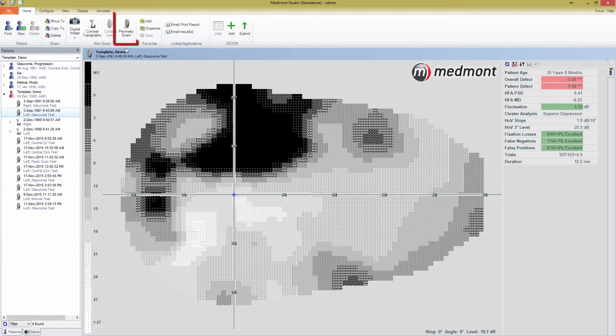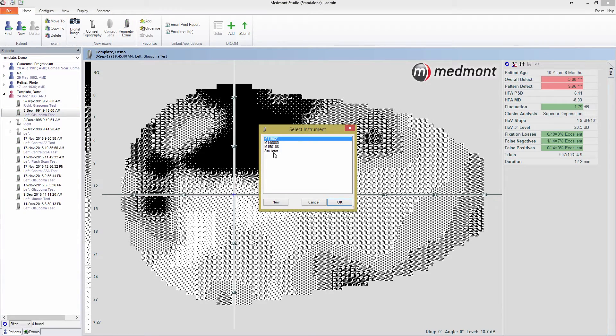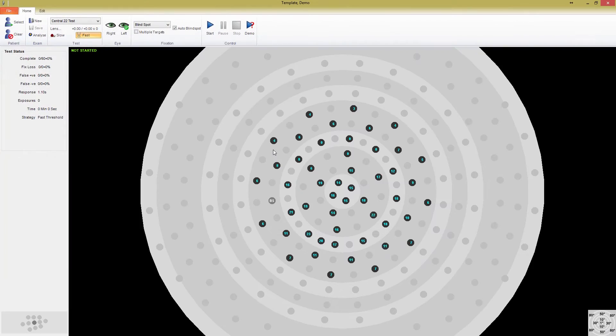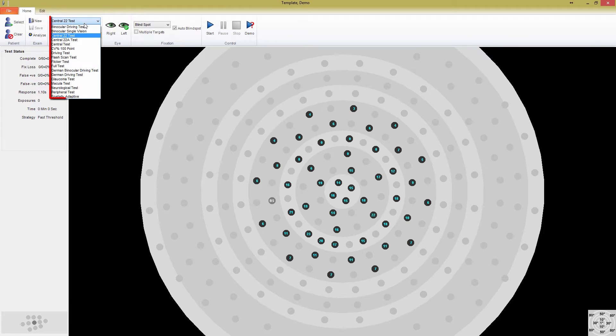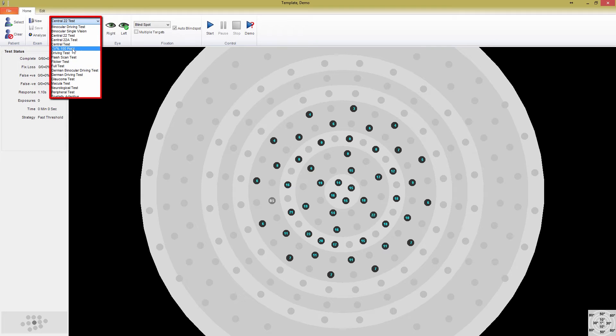Start by pressing the Perimetry Exam button and choosing the perimeter you plan to use. Once the test window opens, select the test template you want to work from. Medmont doesn't offer the ability to create blank templates, so select a pre-existing template that is most similar to what you intend to create. I'm going to make a sparse adaptive threshold test, so I'll start with the 22A test template.